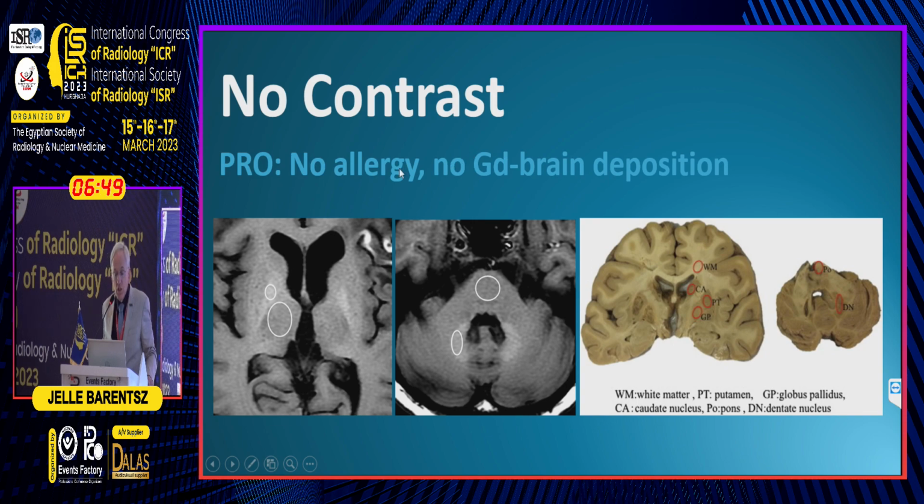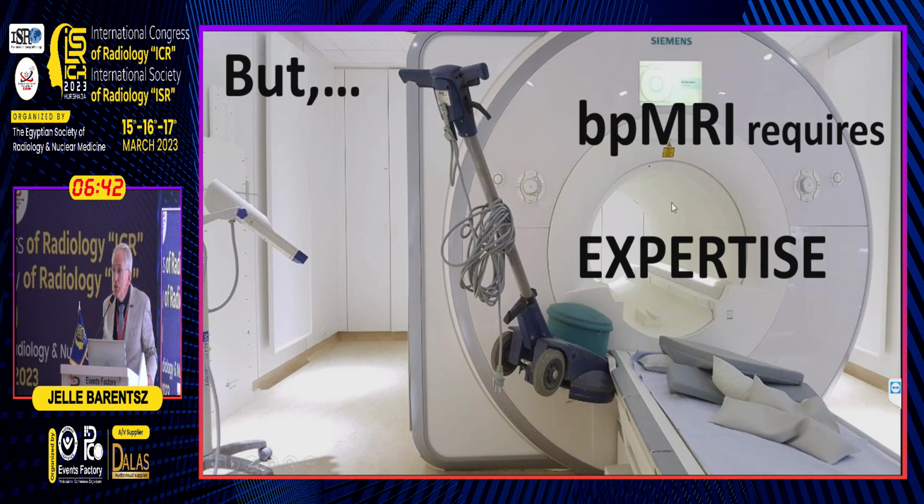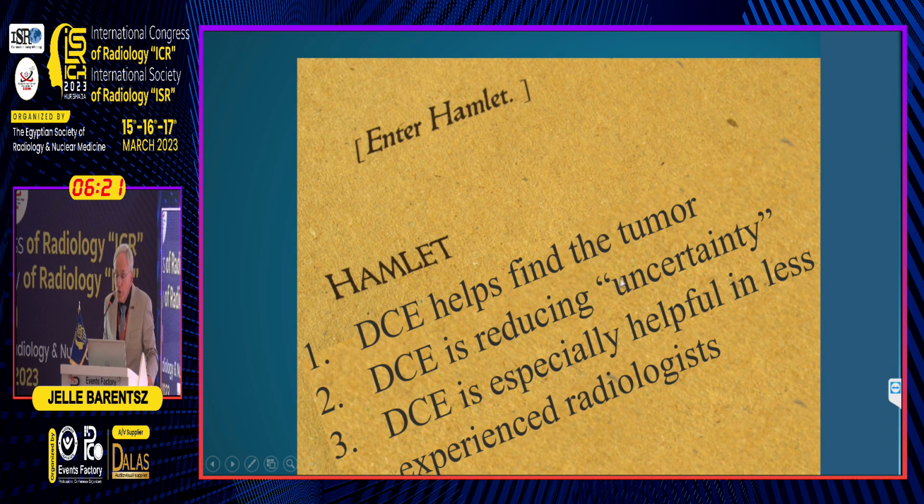You have no allergy, no gadolinium brain deposition, lower cost, easier. However, you need expertise, because if you don't have expertise, you need to have contrast. Contrast will help you. For the experts, it is not that helpful. However, for the non-experts, or when the MR is not optimal, you do need contrast. And I need it still every day. So, contrast helps to find the tumor, is reducing uncertainty, and is especially helpful in less experienced radiologists.